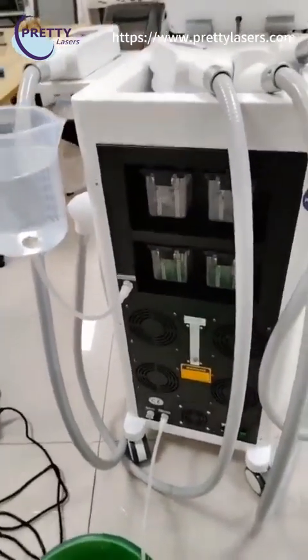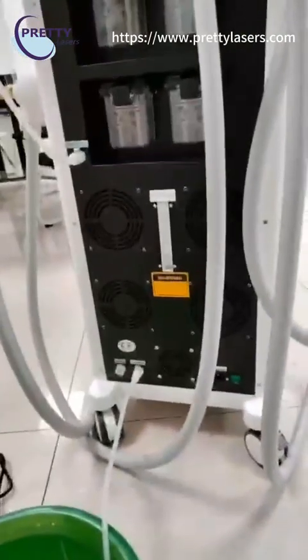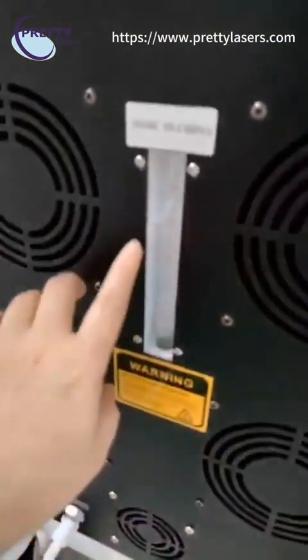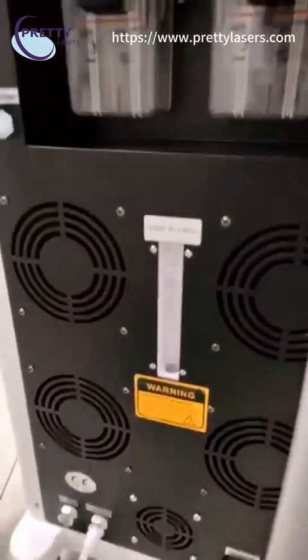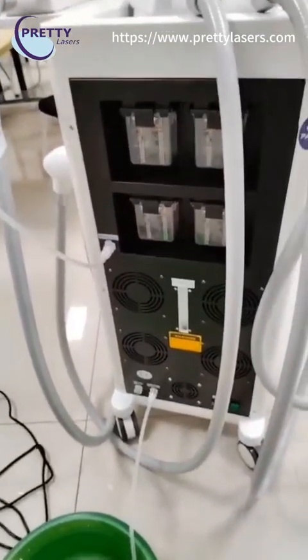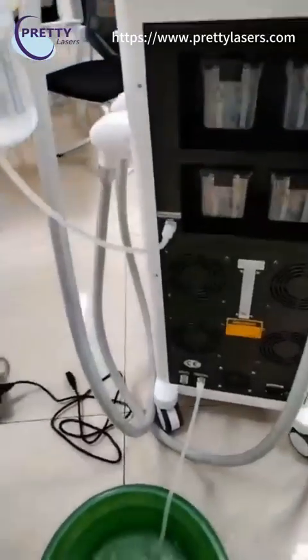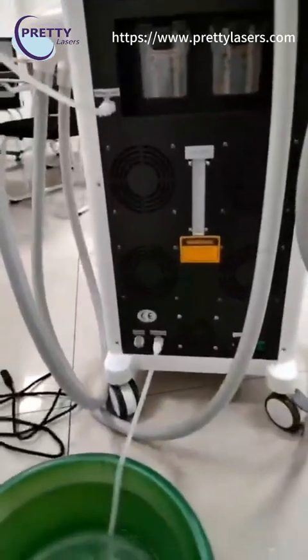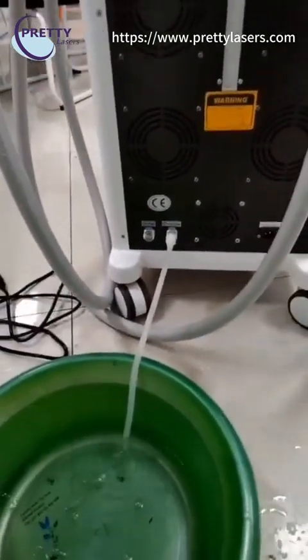When it is full, the water will come out from the overflow hole. This machine takes a total of nine liters of water. When the water is full, water will come out from the overflow hole — that means the water is enough.